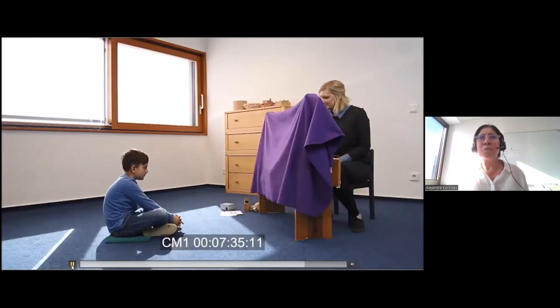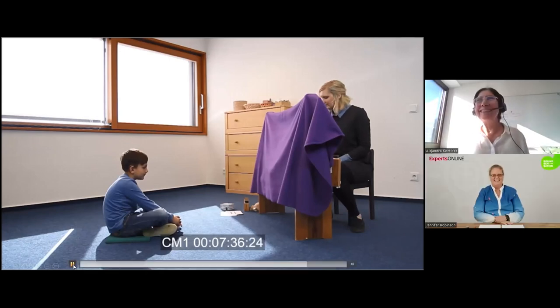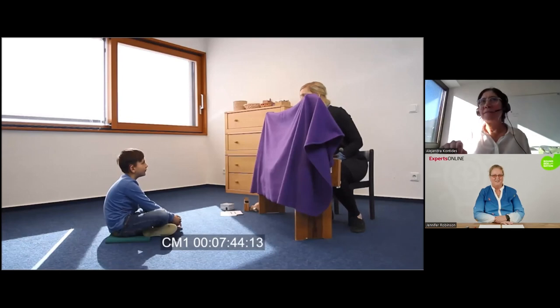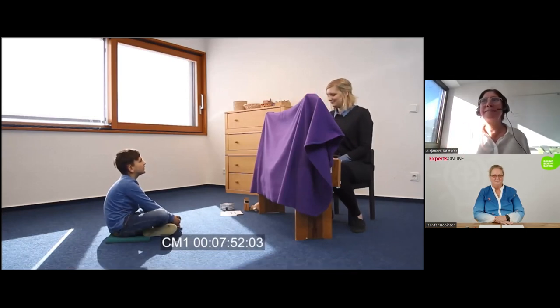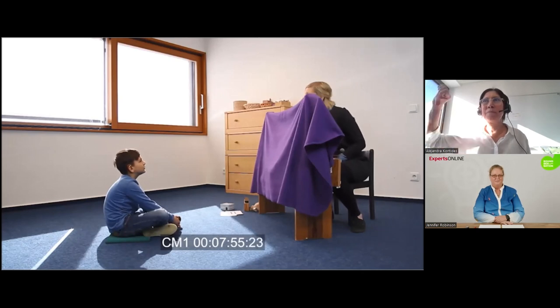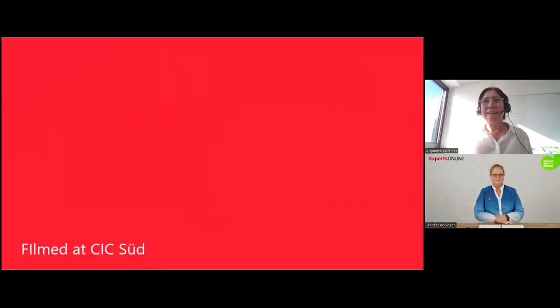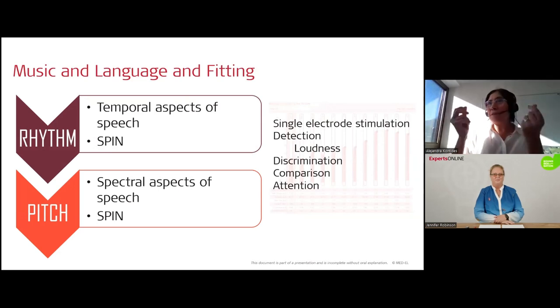And the last one that is the most difficult one because it has to do with contours. And the task in this case will be that the child has to say if this sounds nice or if it sounds incorrect. I know, Jennifer, I have a little time. I finish soon. Richtig, correct. Falsch, incorrect. Yes. Correct. Good, Leo. Auch falsch. So I left it until the end because I want you to appreciate how little differences can be realized with a child that has never had normal hearing.